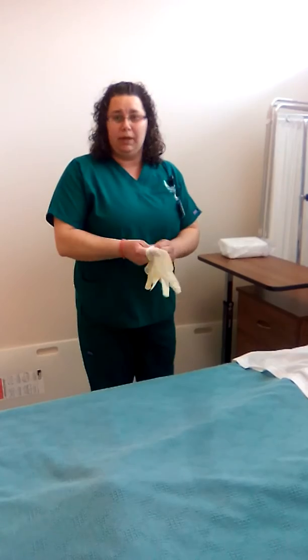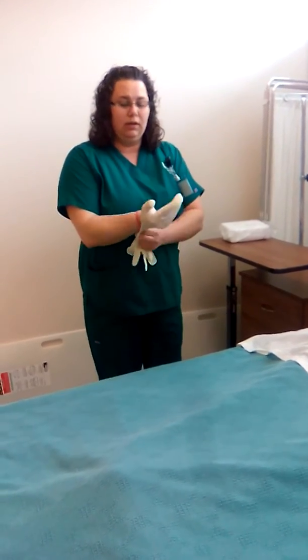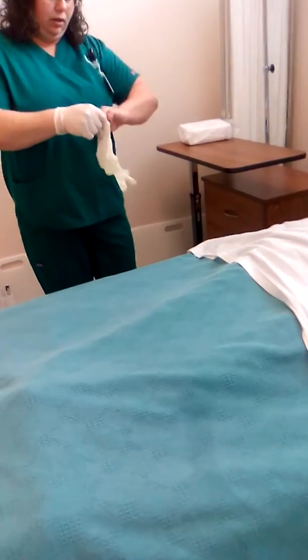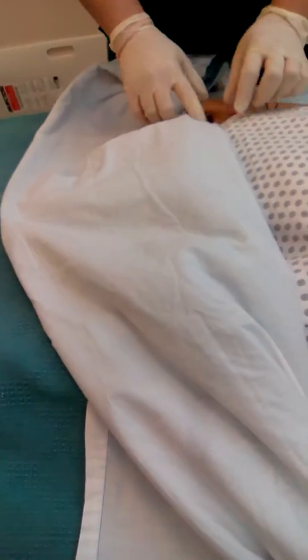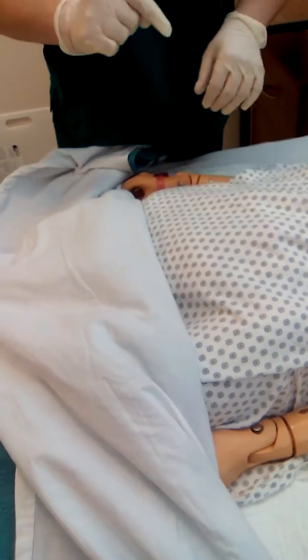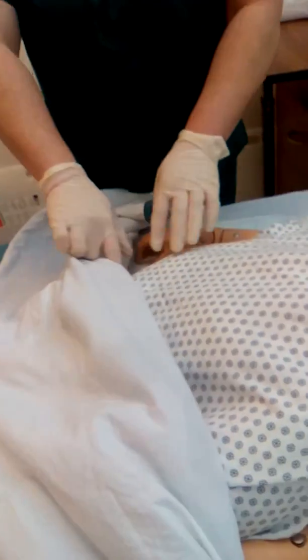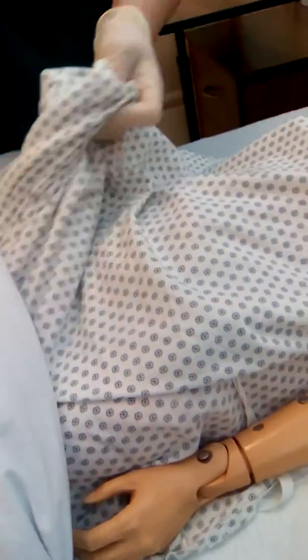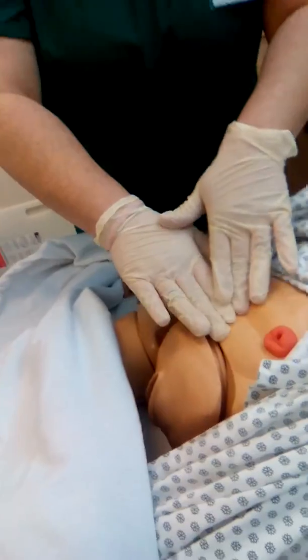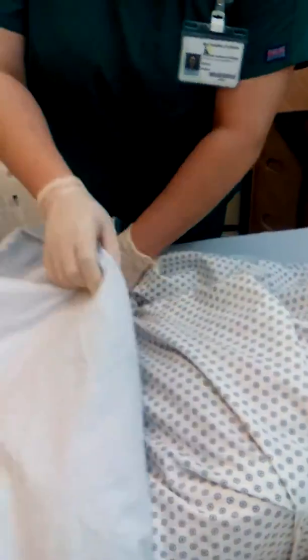I am going to palpate the bladder for fullness. I would be able to use a bladder scanner if needed. And I would raise that side rail. Will you raise that for me real quick? Have my assistant raise the side rail for me. I would palpate the bladder for fullness.